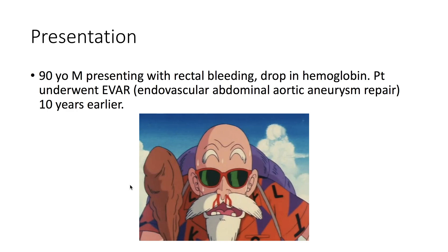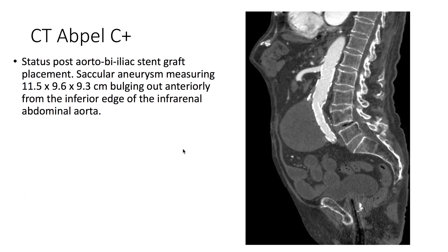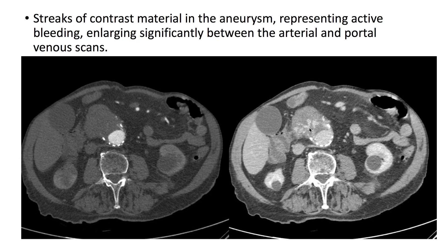This patient underwent endovascular abdominal aortic aneurysm repair 10 years earlier. On CT of the abdomen and pelvis with contrast, we can see the aortobiiliac stent graft. There is also a saccular aneurysm bulging out anteriorly from the inferior edge of the infrarenal abdominal aorta, with streaks of contrast material representing active bleeding. These streaks enlarge significantly between the arterial and portal venous scans.